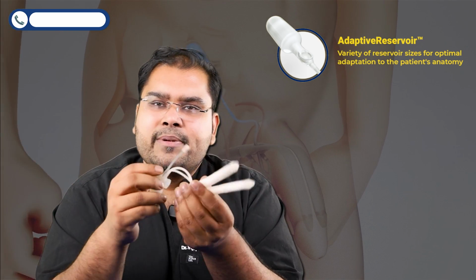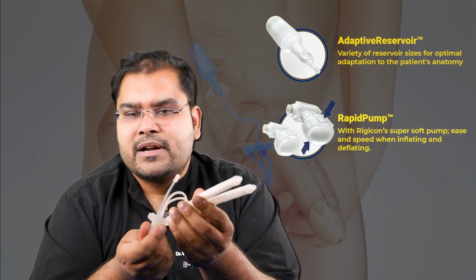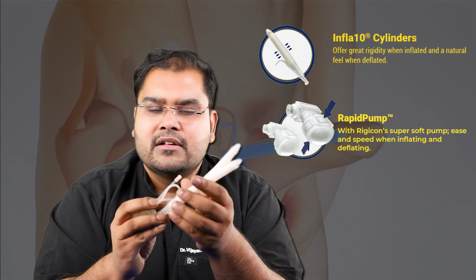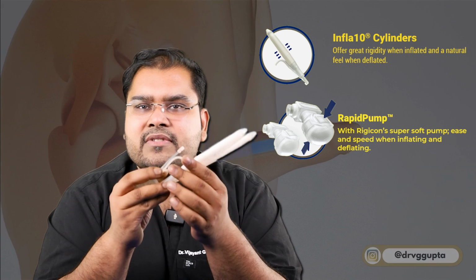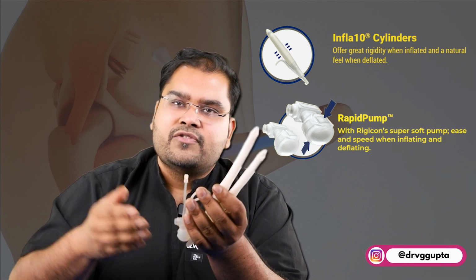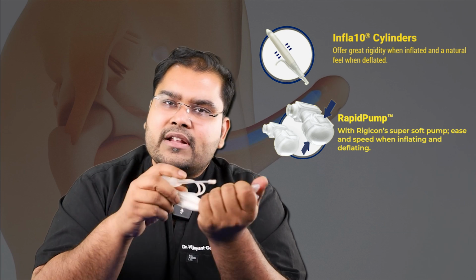On the other hand, the inflatable penile prostheses are completely soft. So there is nothing inside, but there is a balloon of water. So when the patient wants to have sex, he pumps the implant, which carries the water from the balloon inside these, and these become fully hard. They're fully hard, good enough for sex, and when sex is over, the patient can just press the deflate button and the water flows out, and these again become soft.